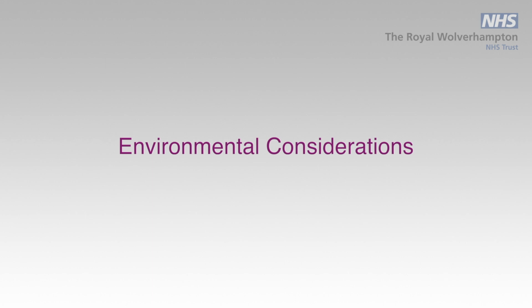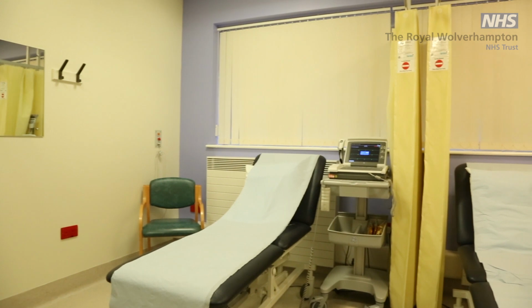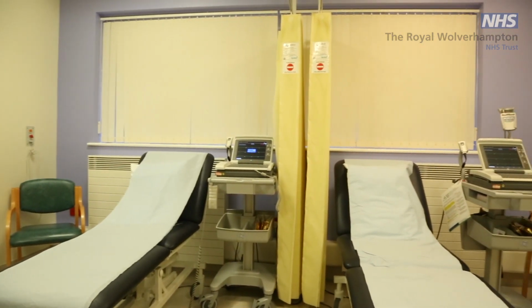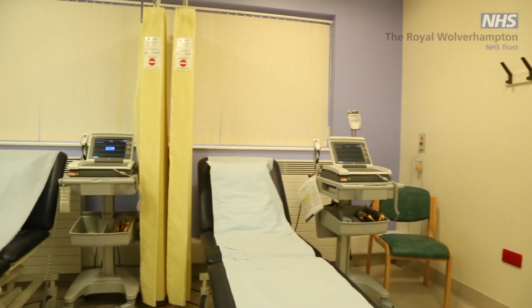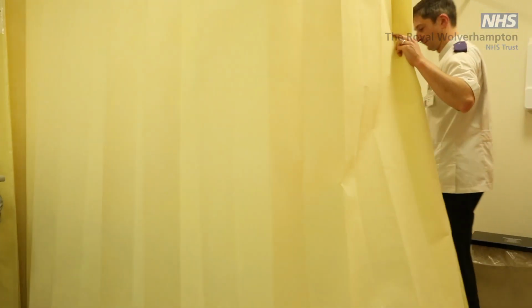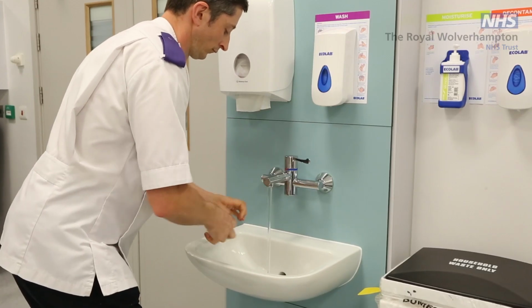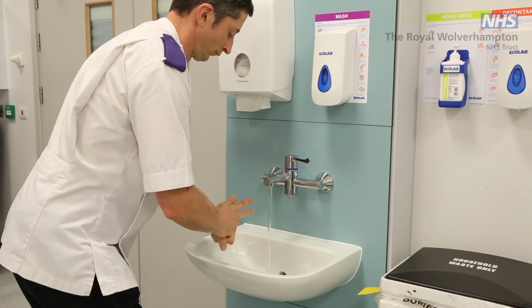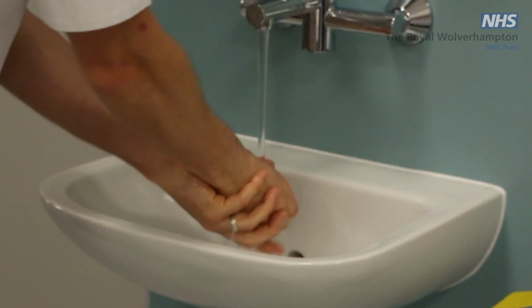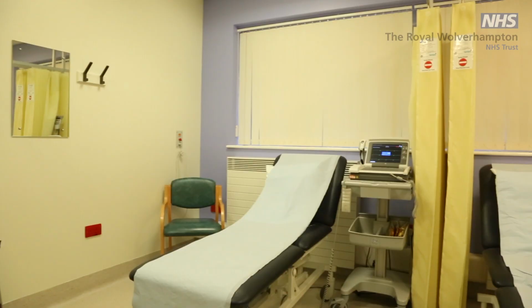As far as possible, the area in which the ECG is recorded should be private. It can be walled, curtained or screened off. It should be quiet, comfortable and accessible for disabled and able-bodied patients and staff. It should be safe and clean with appropriate hand cleaning and clinical waste facilities, such as a yellow or orange bag and a sharps container. It should be furnished with a height adjustable couch or bed that can be accessed from both sides.